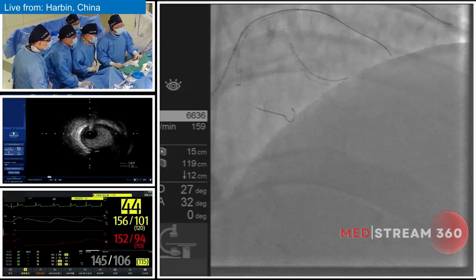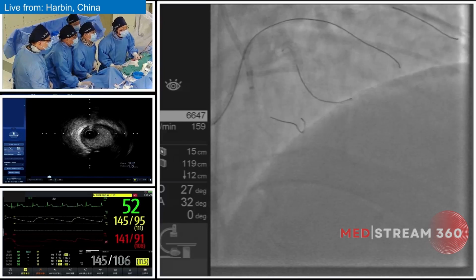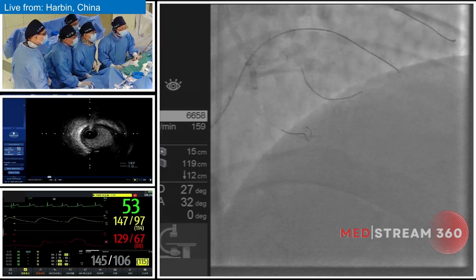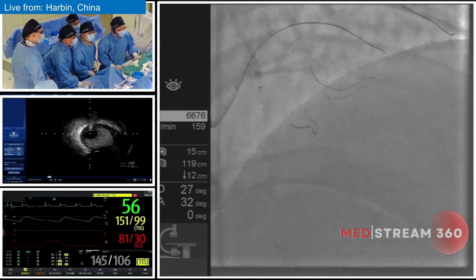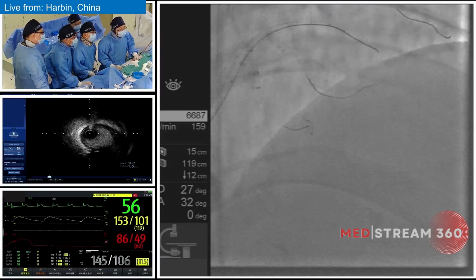There are several issues that we need to clarify during the ADR techniques. For this case, although it's an LAD occluded segment, we may try our best to avoid all the important side branches. So this is number one information that supports us to perform the ADR techniques.